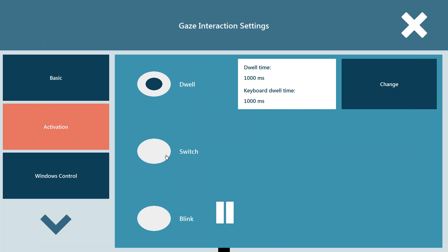You can also access via switch. So if you have a switch plugged into the device, you can look at the button you would like to select and then physically hit an external switch with a hand, a knee, a finger, whatever that may be to actually make the button selection.